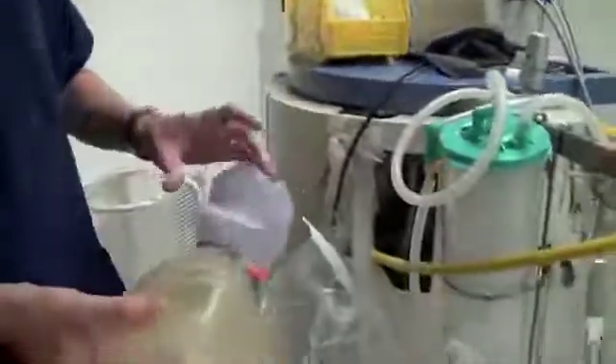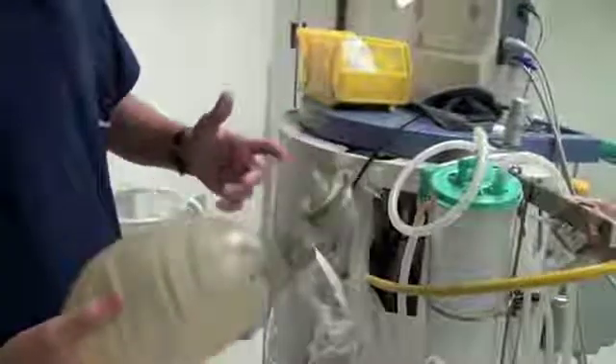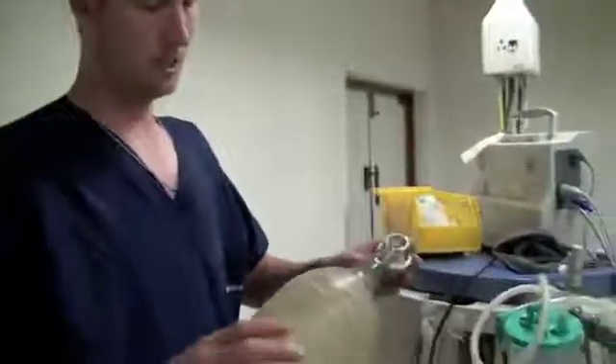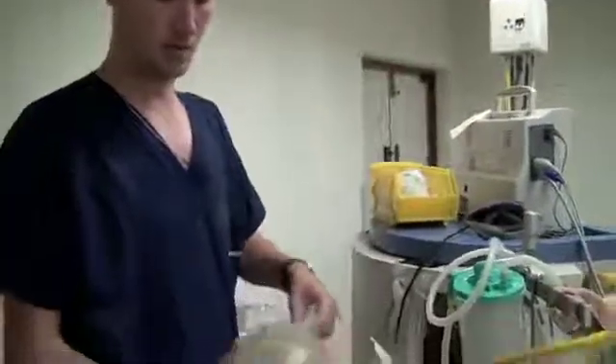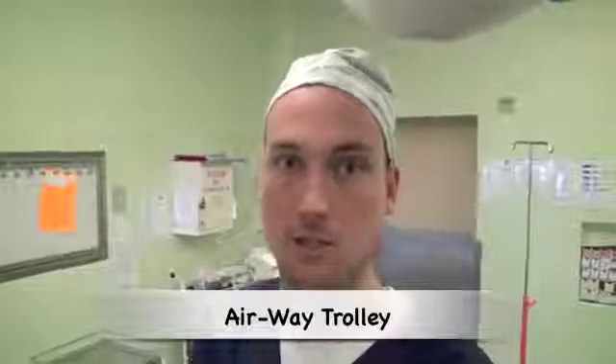Anaesthetic machines don't keep people alive — they ventilate people and keep them asleep. What you need to keep someone alive is an airway and some oxygen. So an ambu bag would be the most basic piece of equipment that you need. Part of the anaesthetic machine check is checking the airway trolley, which has been covered in another video.